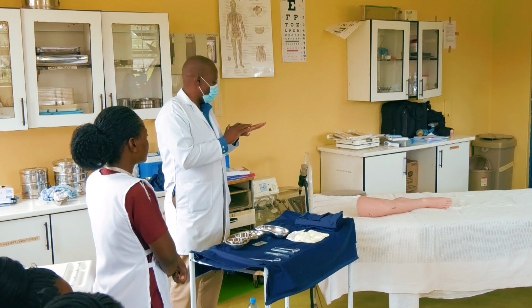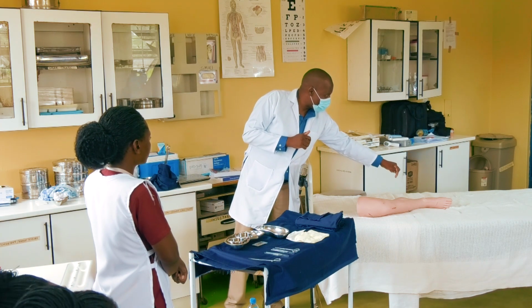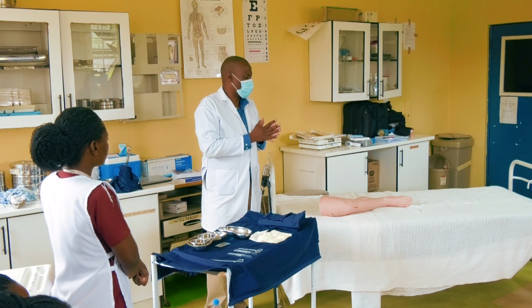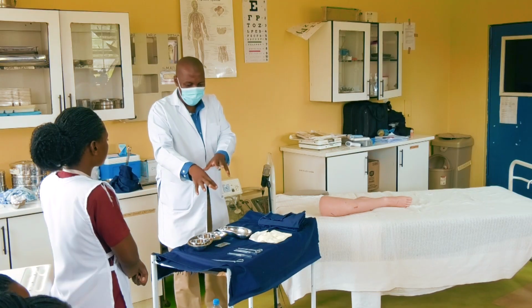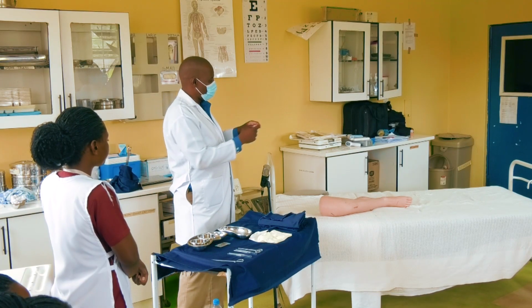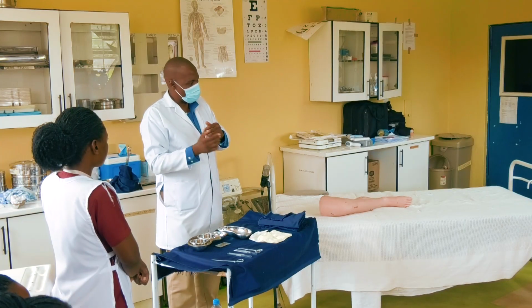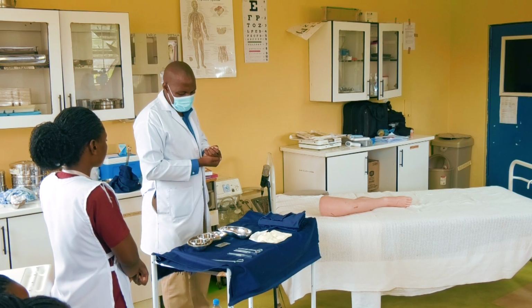So from the skin here, what is on this skin, if it goes inside the tissues, it can cause infection. Then the wound gets infected. So I don't want to get my normal flora transferred to the patient. By touching anything here which is going to get in touch with the patient, I'm transferring. That's the chain that we were talking about when we talked about the principles that you are supposed to know.